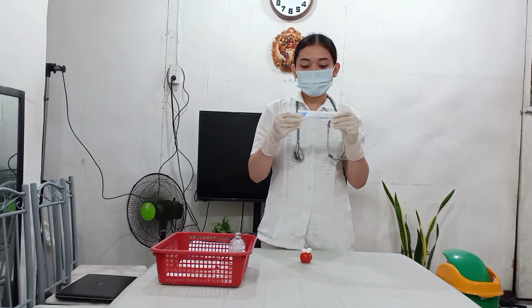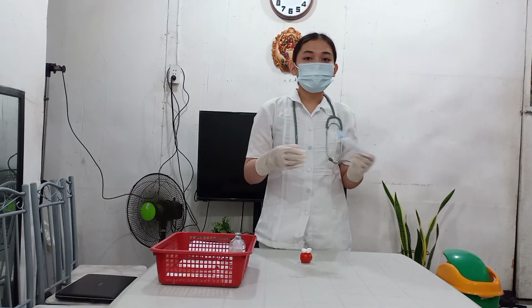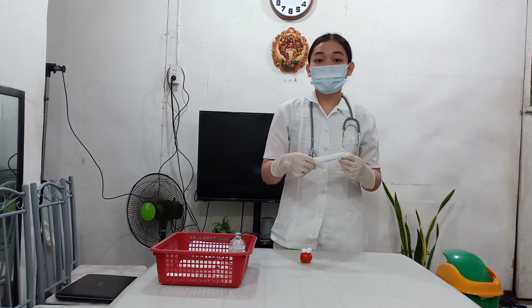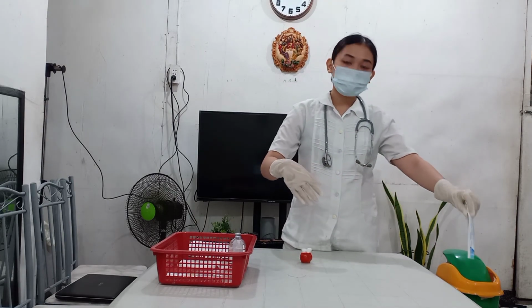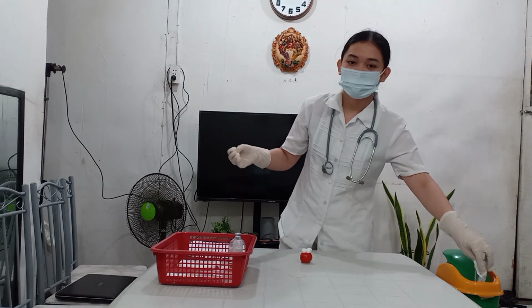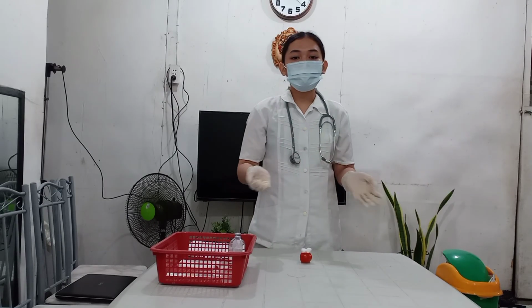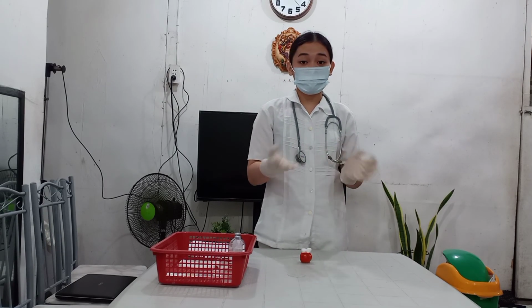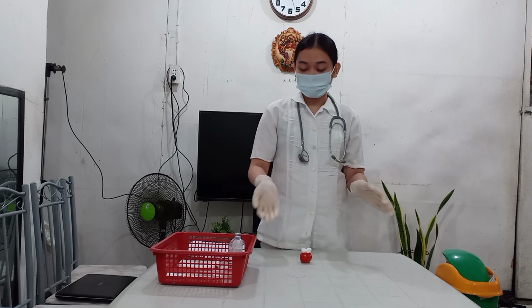So, I have here the syringe that I used, and I will throw it. Ideally, you have to throw it in a sharps bin. So, assuming that this is my sharps bin, I will be disposing that syringe here. Now, we remove gloves and wash our hands. This is to prevent the spread of infection.